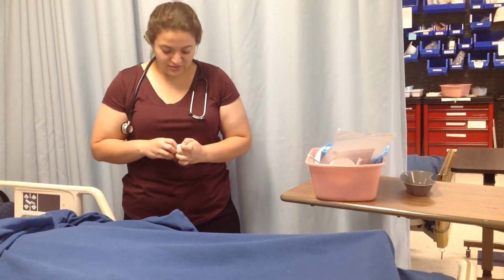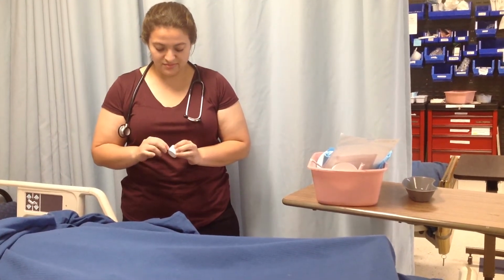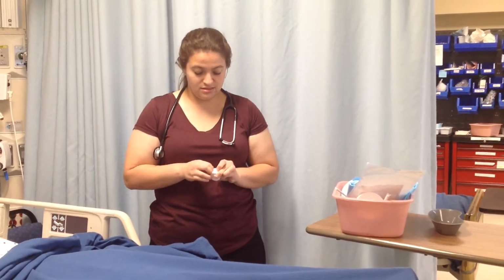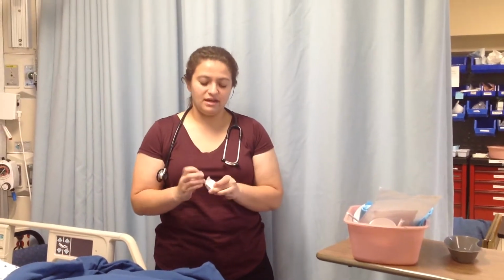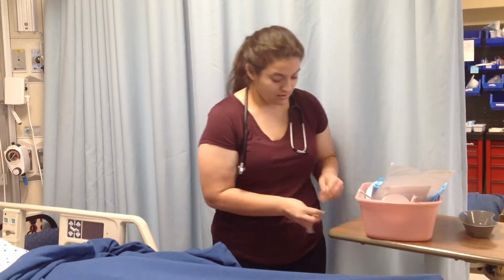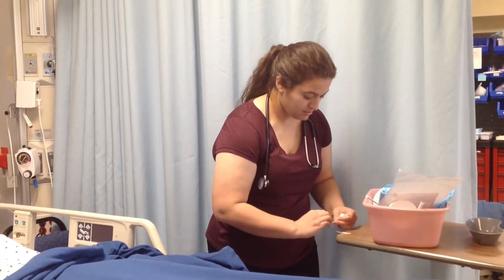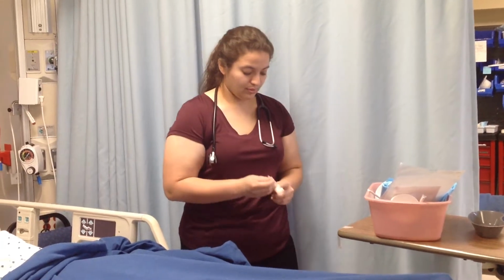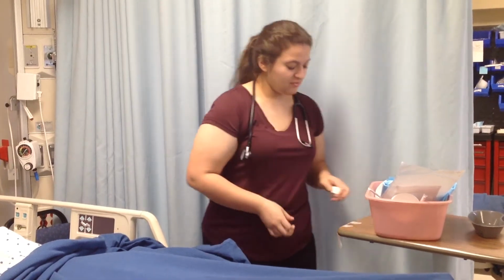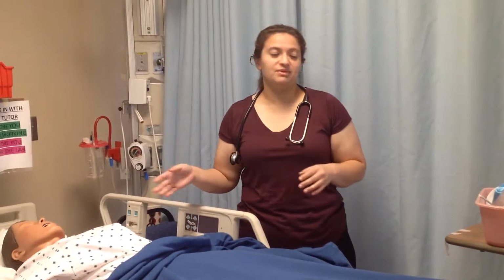A piece of this tape I'm going to use to tape the tube to the patient's nose, just to hold it in place. I just want to get my tape out now so that I'm ready for the procedure. Just put a piece there. And I'm going to get another piece of tape so that I can measure at the end of the tape, once I measure the tubing.